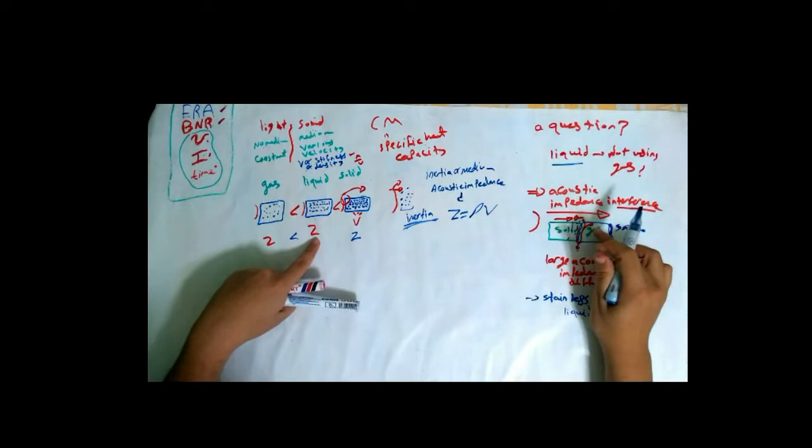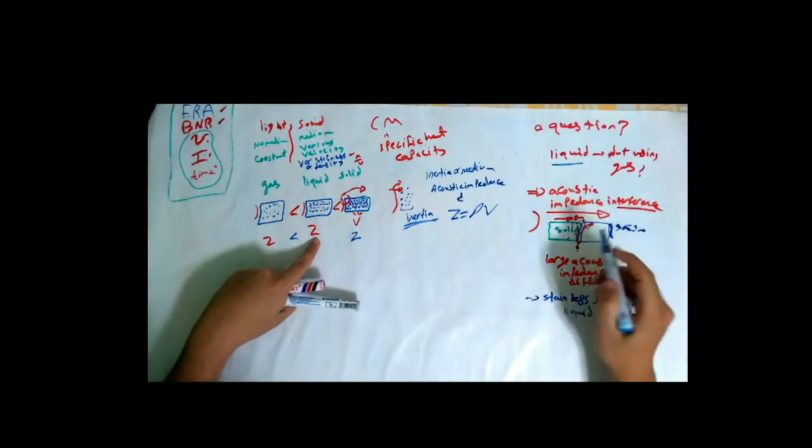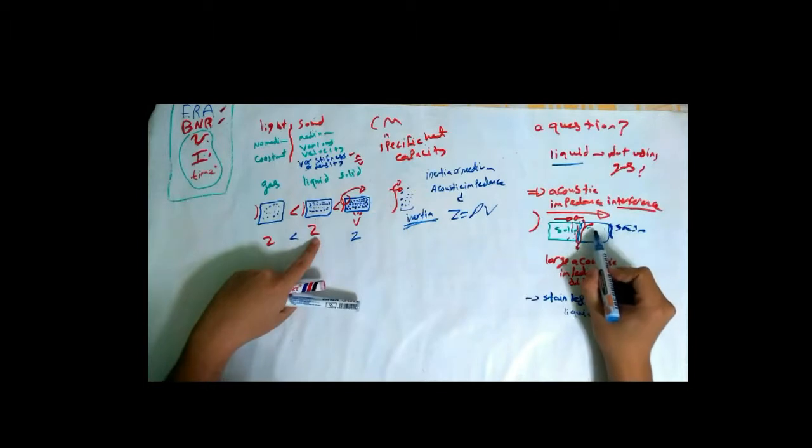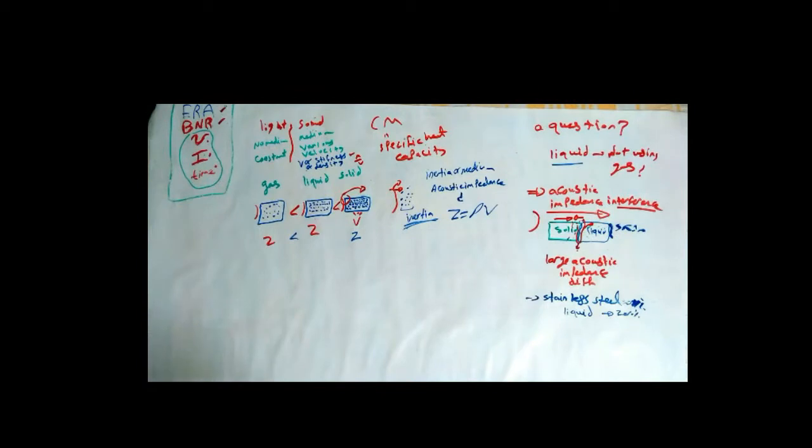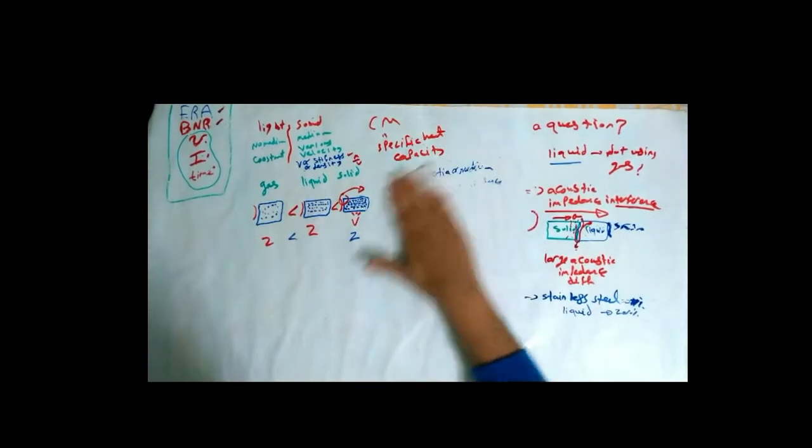So I'm using here, during ultrasound therapy, liquid or gel, to avoid this point, which is acoustic impedance interference. Now let's talk about how to use the parameters after understanding these scientific terms. Let's remove this part.